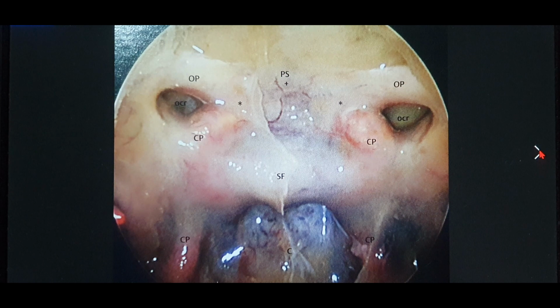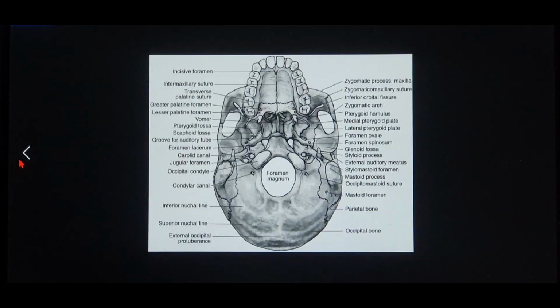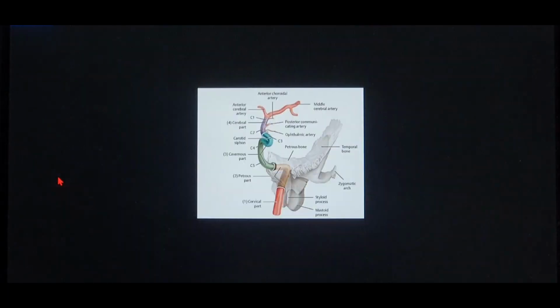Now this is the image of the endoscopic surgery which a skull-base surgeon, that is an ENT surgeon, and a neurosurgeon will encounter when they are operating in the sphenoid sinus. Now this is the sphenoid sinus. As you can see over here below, this is the paraclival carotid, as you saw in the very first image which I showed you.